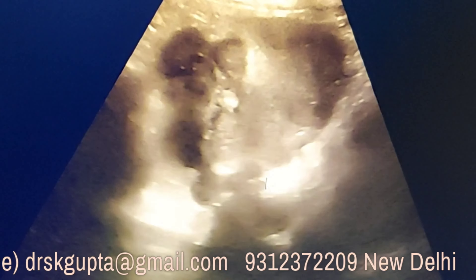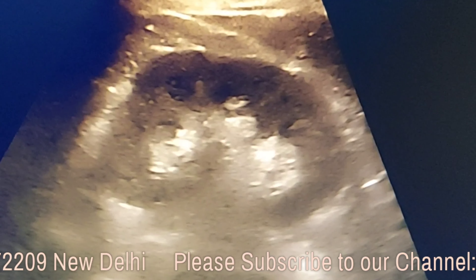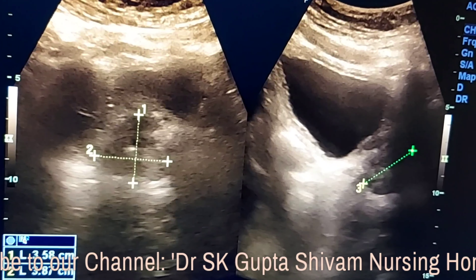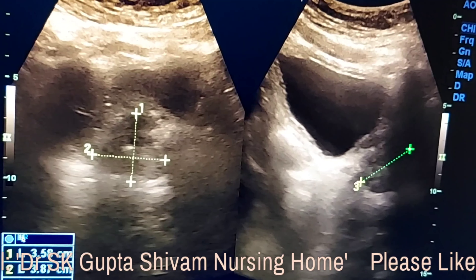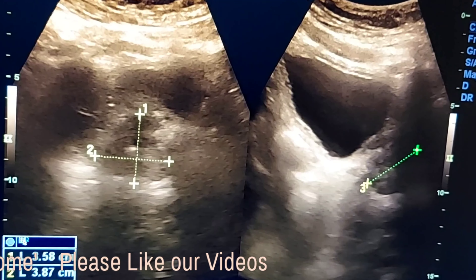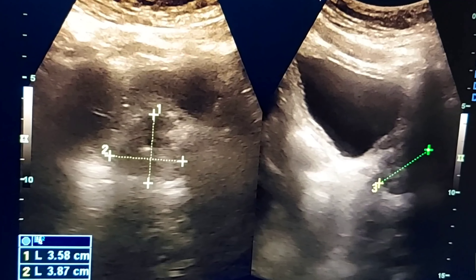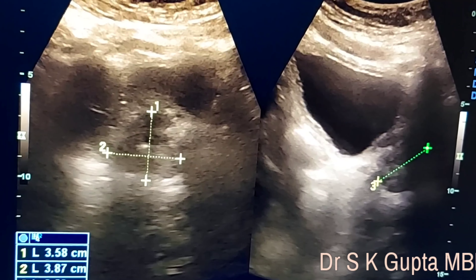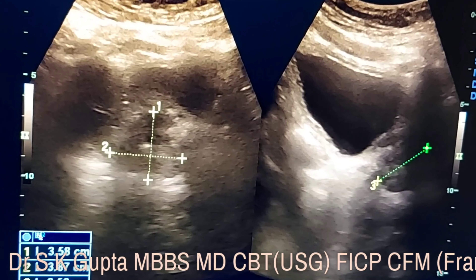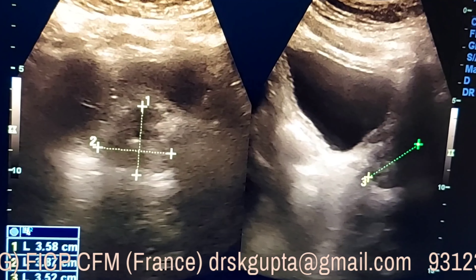The CBD appears to be dilated and this is the portal vein. The kidney of the patient was normal. The prostate of the patient was found to be normal, meaning there is no prostatic malignancy. The patient, around 55 years of age, presented with complaints of loss of appetite. So we are dealing with a case of secondaries in the liver causing loss of appetite, and the primary is likely gallbladder carcinoma in this patient.